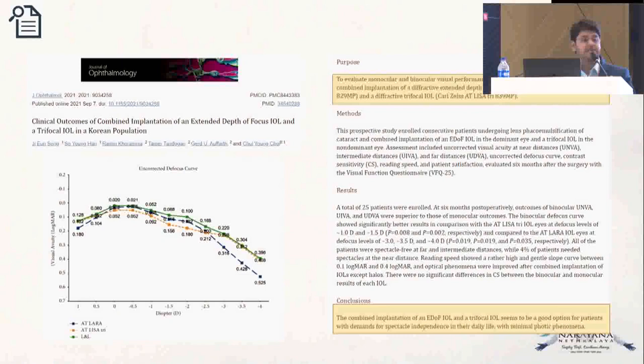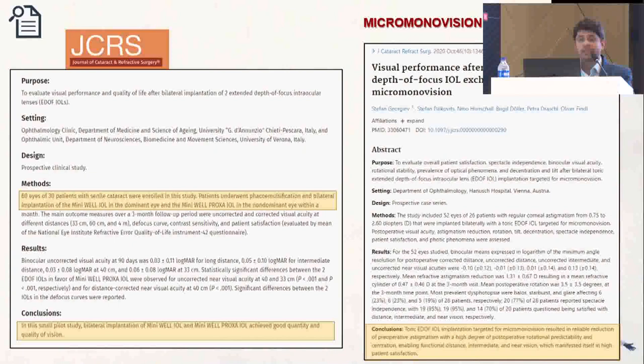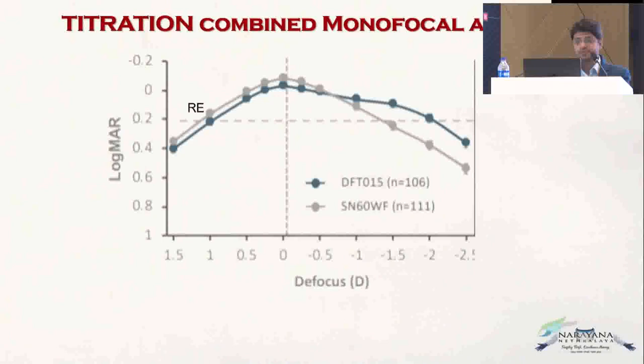With toric EDOFs, when you're considering micro monovision, you should be sure that you put a toric lens if the patient has residual astigmatism, like I mentioned earlier, because if not, then the distance vision will get compromised and the benefit that you're getting with micro monovision will get compromised.